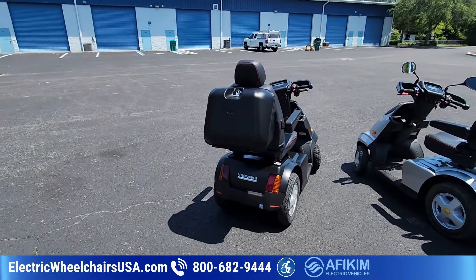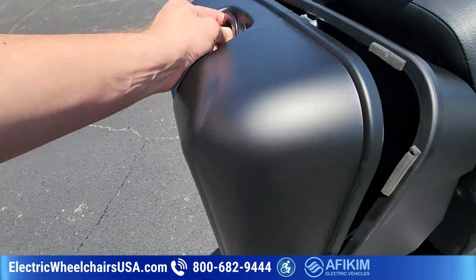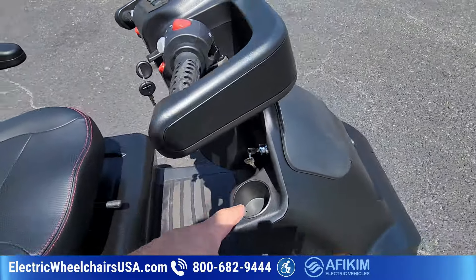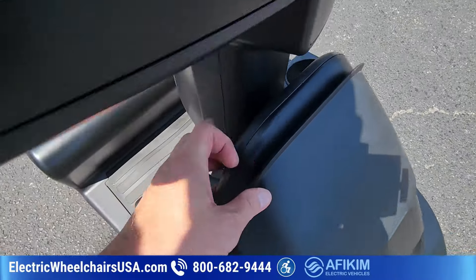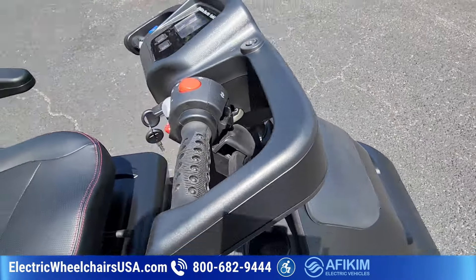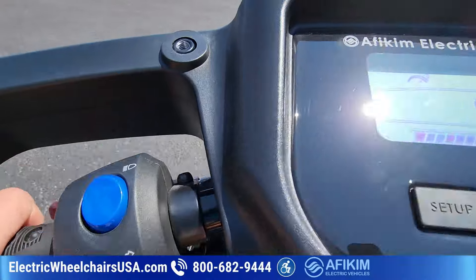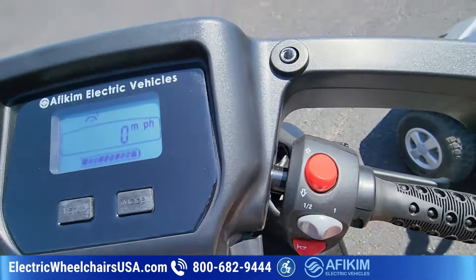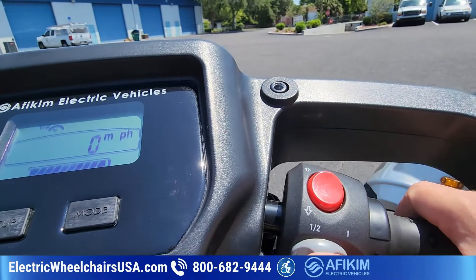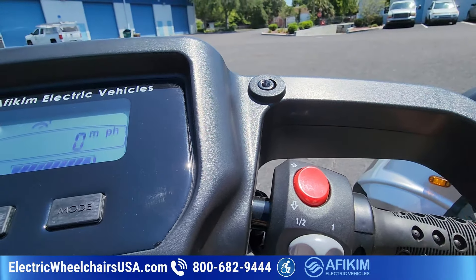This matte black one you see here is a standard model, so it has the 20-inch wide seat. It comes standard with a rear storage compartment on the back that is lockable, so you have a set of keys for that. There is also a front lockable storage compartment with its own set of keys. You have two cup holders on the front. You can adjust this tiller — if you want to pull it towards you, you can do that. This is the forward and reverse switch, and this is your speed control. You have a half-speed and a full speed. The full speed is your top speed — when you fully accelerate, it's around 10 miles per hour.